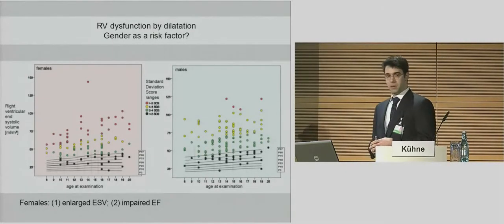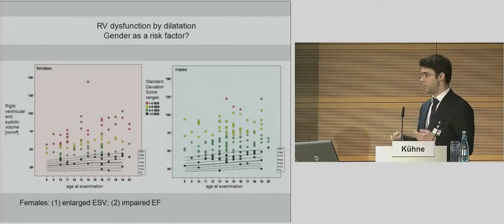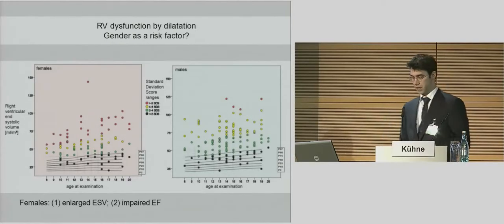And we have to keep in mind that we do not only look at the myocardium itself if we are talking about myocardial performance and contractility, but we definitely also have to see the geometry, the size of the ventricles, the ventricular dilation.